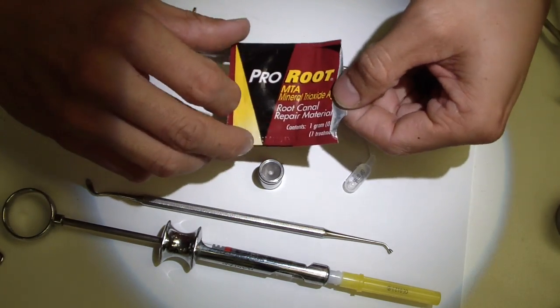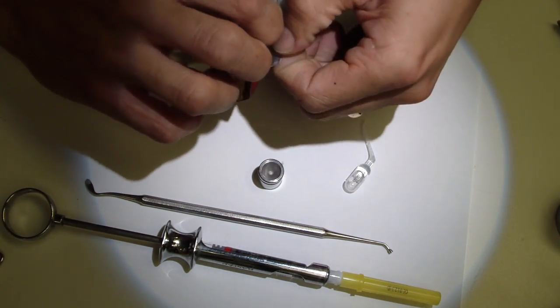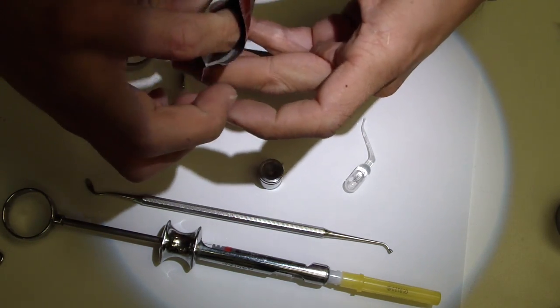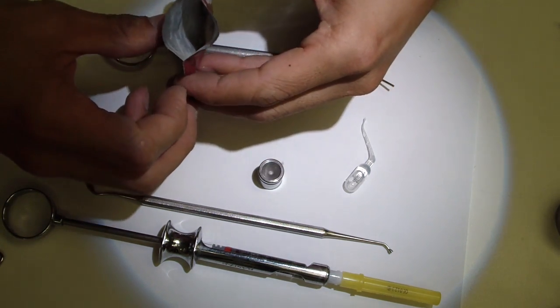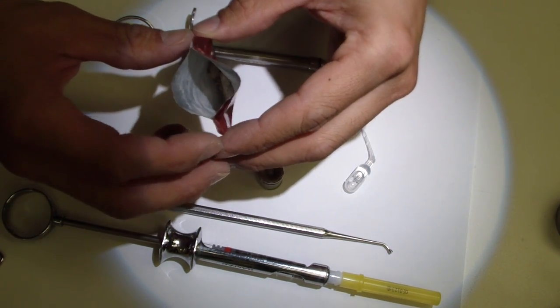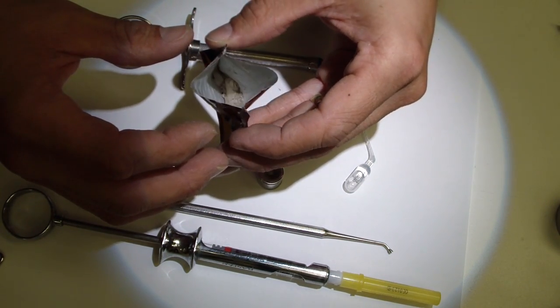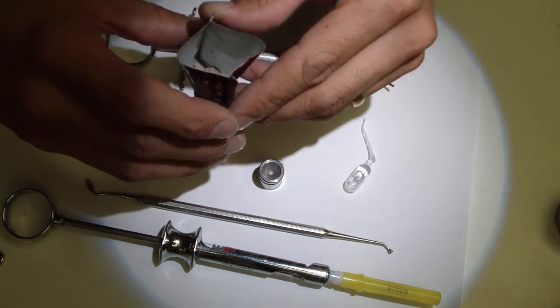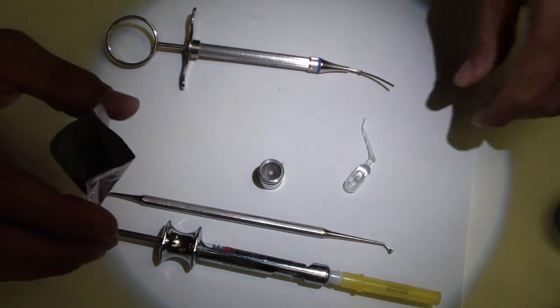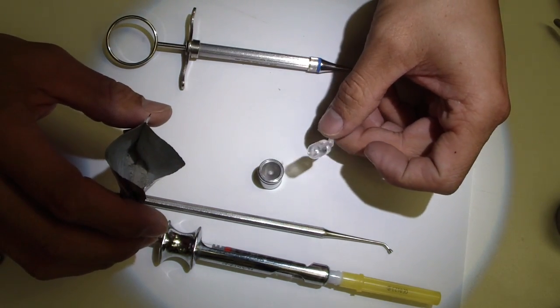So MTA typically comes in gray and white form. Here it is in the powder, let's see it in the container, there it is. And in the box container itself, the manufacturer sends sterile water.